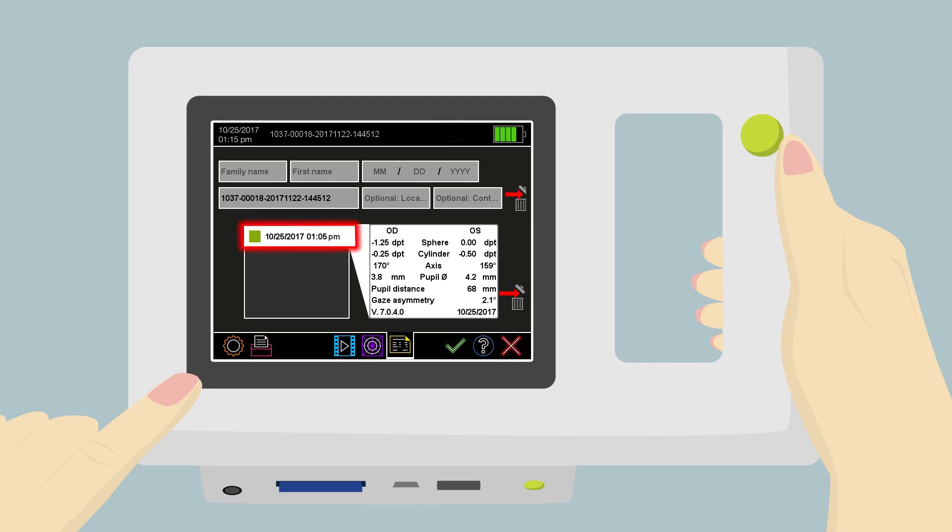Green entries indicate successful measurements. Aborted measurements are not portrayed. The label can be viewed and printed again at a later time and new measurement results can be compared to previous measurement results through the patient database.